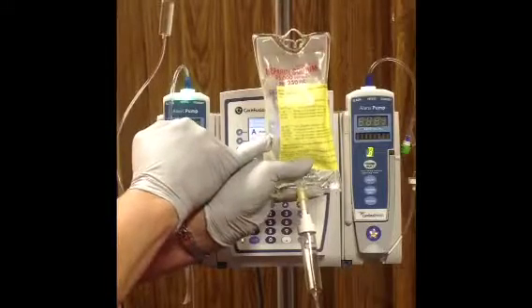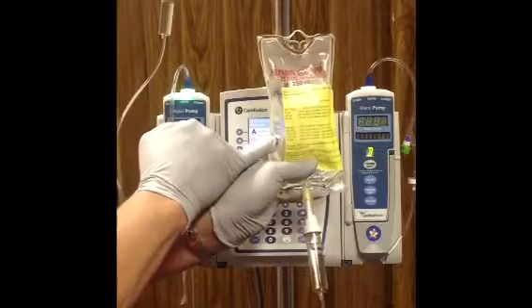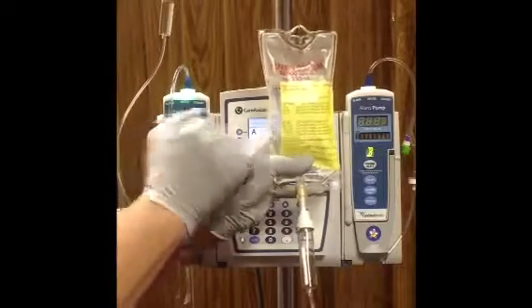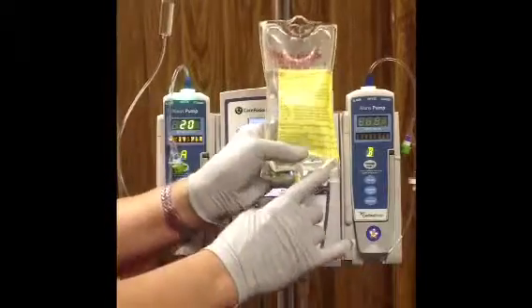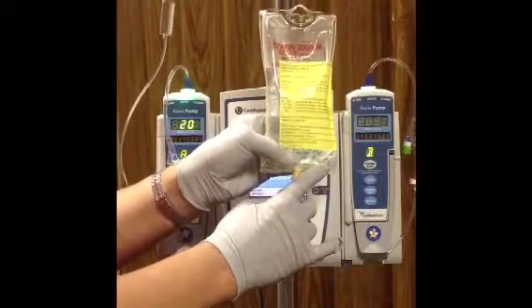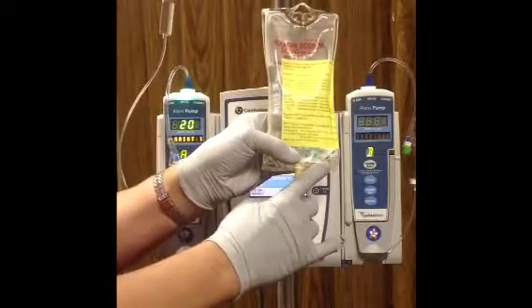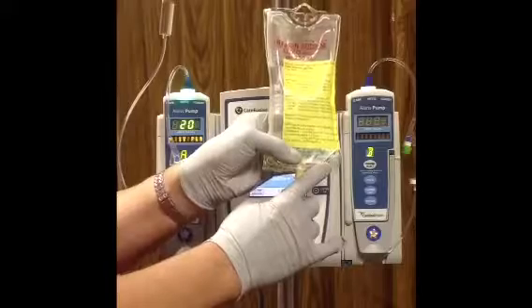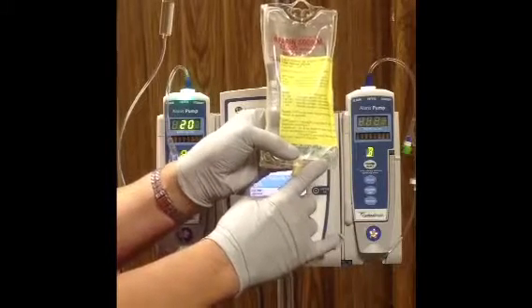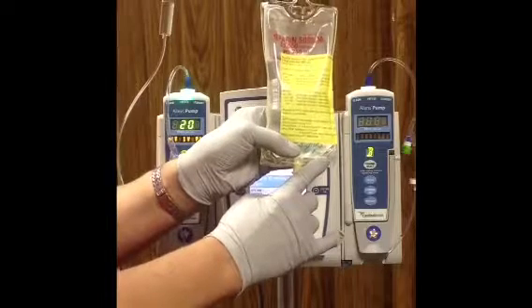Another example of a medication that you might see pre-mixed would be magnesium sulfate. There are also bags that will be mixed in the pharmacy. These will come with a medication label that has a barcode on them for the medication. An example would be cefazolin, which we just hung as a secondary.